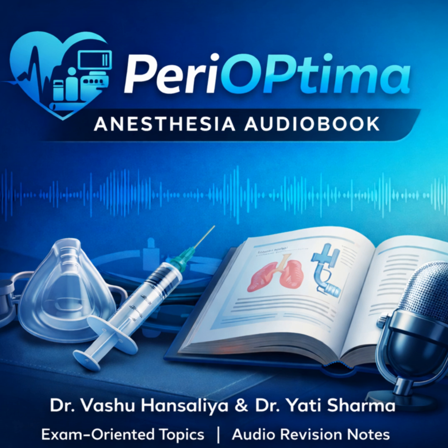But you have to remember the equation of motion. If you fix the volume, what becomes the variable? Pressure. So if your patient bites on the tube or gets a big mucus plug or their lung suddenly gets stiff from ARDS, the pressure required to force that 480 milliliters in is going to shoot up. And that's the big disadvantage. That's the huge disadvantage, high peak pressures. This puts the patient at risk for barotrauma, literally, pressure injury. You can pop a lung, cause a pneumothorax. So in VCV, your eyes are constantly glued to that peak pressure alarm.